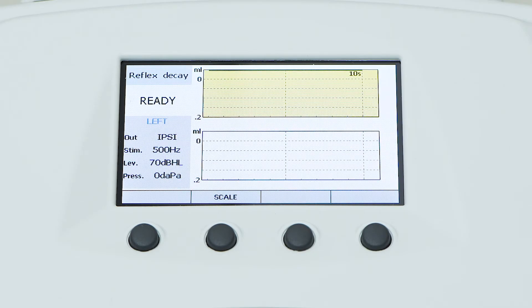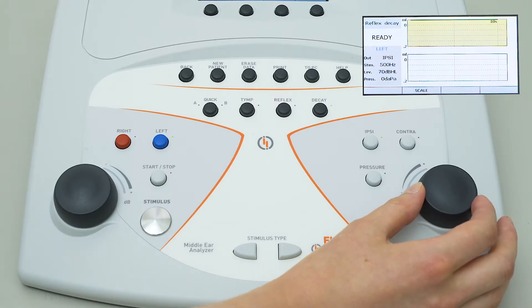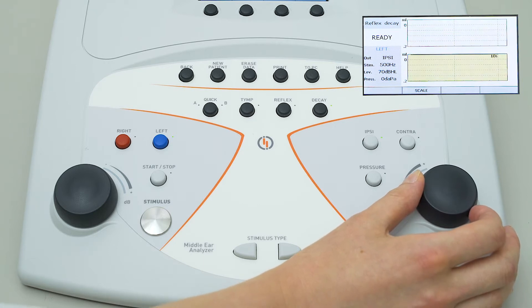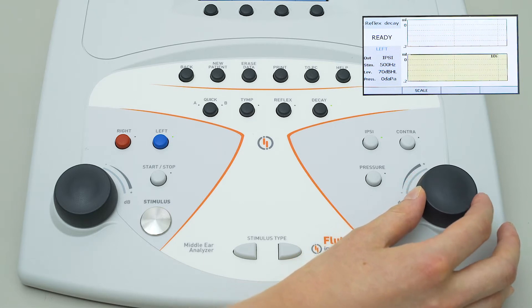Four different graphs are available for each ear. Graphs are shown two by two, and the operator can navigate from one to the other using the right-hand control knob.